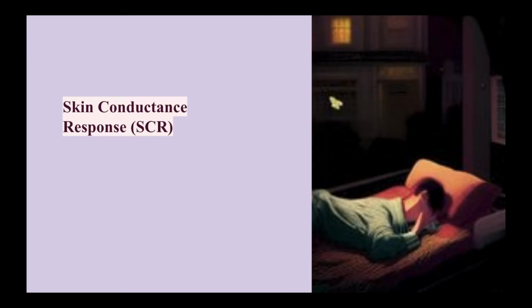If your goal for training is a reduction of stress, then the amount of SCR per minute should decrease over several sessions. The average value in the microsiemens of a session is an indicator for the level, hence your basic level of tension or relaxation.